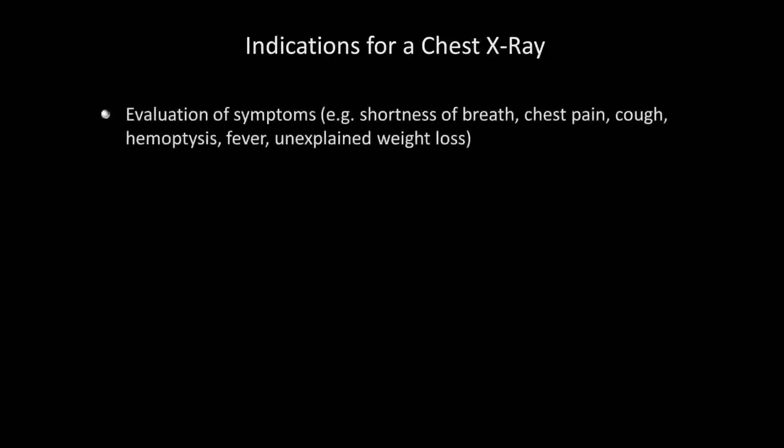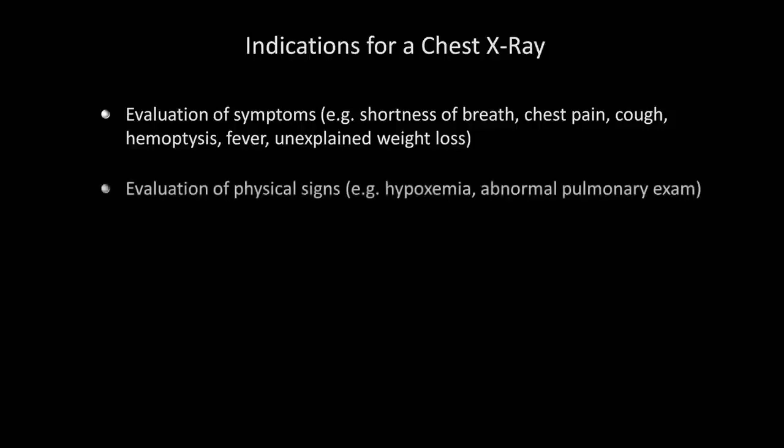Along with the EKG, the chest X-ray is one of the most common diagnostic tests in medicine that does not involve drawing blood. There are many indications for getting a chest X-ray. They include evaluation of symptoms, which can be shortness of breath, chest pain, cough, hemoptysis, fever, or unexplained weight loss. Evaluation of signs picked up on a physical exam, such as hypoxemia or an abnormal pulmonary exam.